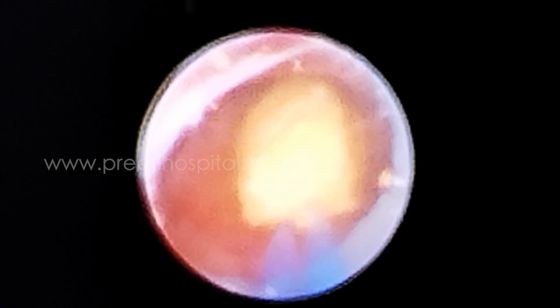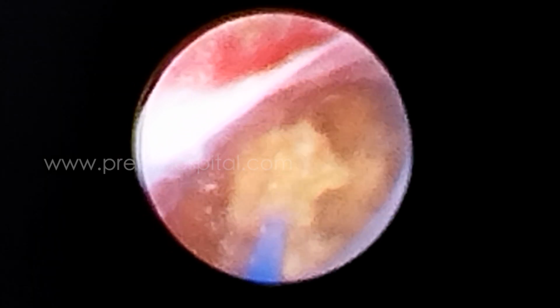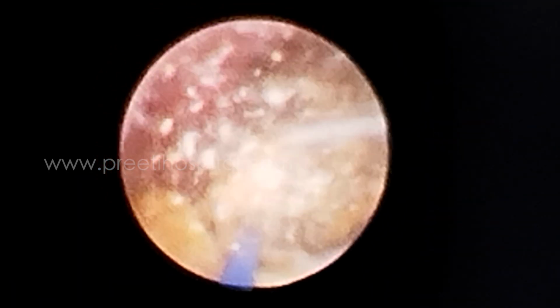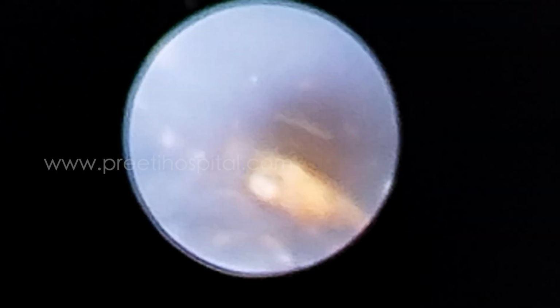Laser. So whenever like this, you break with laser, don't struggle. Spend some time, you go there, don't put water when I am doing it. See how much time it took? 10 seconds. How much struggle you did? 15 seconds. So which is worth? Breaking is the worth. So instead of breaking, if you struggle, you will be unnecessarily getting frustrated. You should not get frustrated.